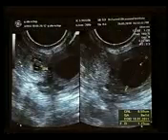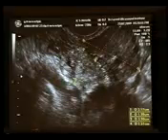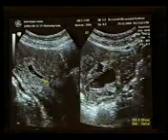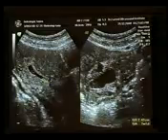This is another ectopic pregnancy, another ectopic pregnancy. Look at the ovarian texture and adjacent ectopic pregnancy texture. Mark the chorionic villi giving a brighter appearance. This is an intrauterine pregnancy, and this is the extrauterine one.